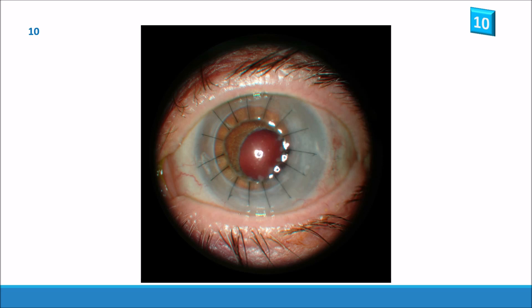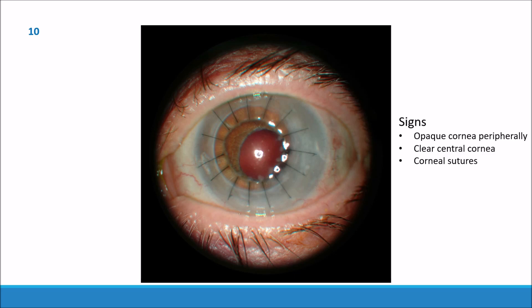And the last slide. You can see the cornea is opaque peripherally and we have sutures 360 degrees with a clear central cornea. This is a corneal graft.